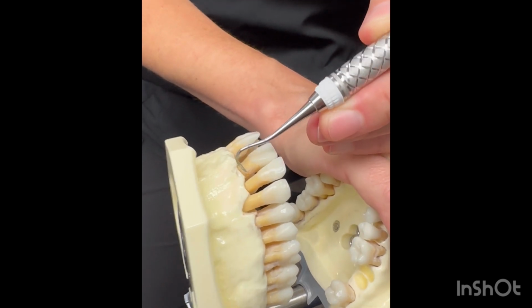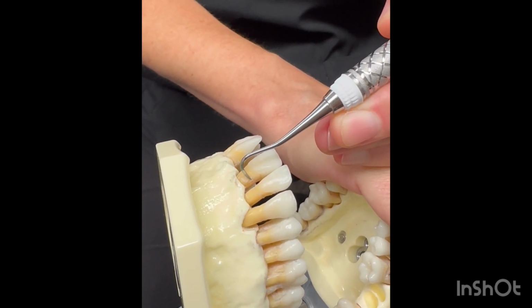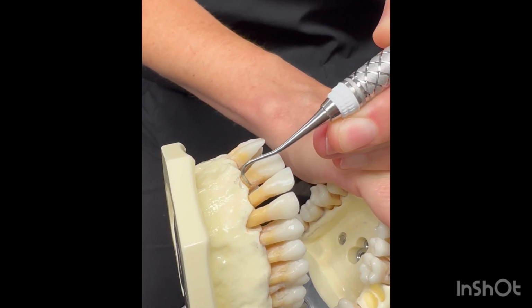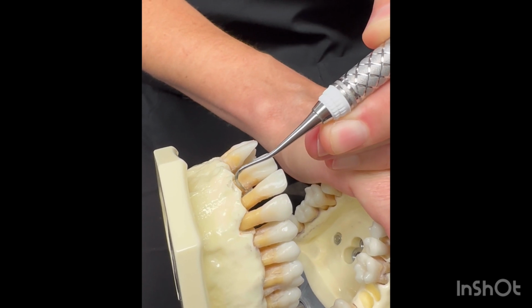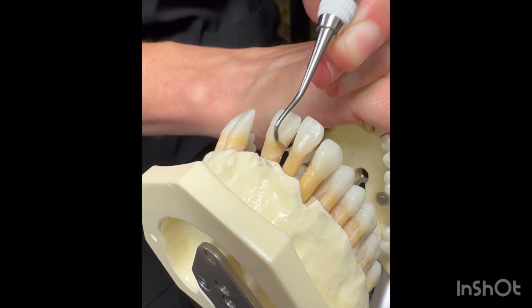So for 1 millimeter of bone loss for the maxillary and mandibular central incisors, the gingiva is typically tighter to the tooth and healthier. So we would use regular instrumentation like our 7/8 sickle and the 5/6 Gracey.